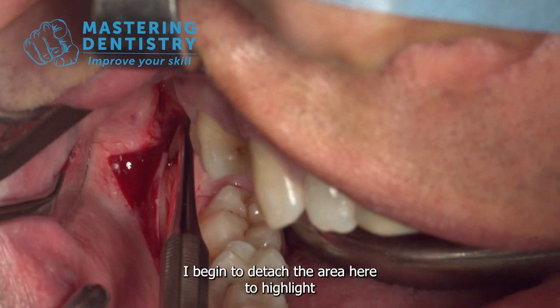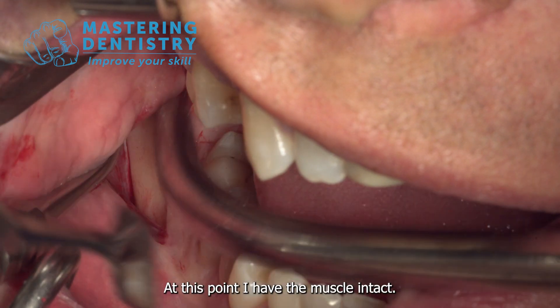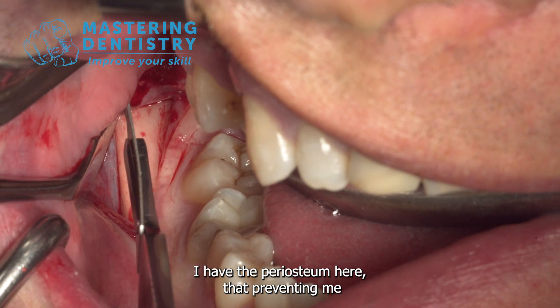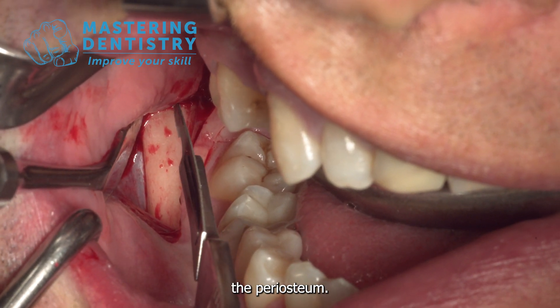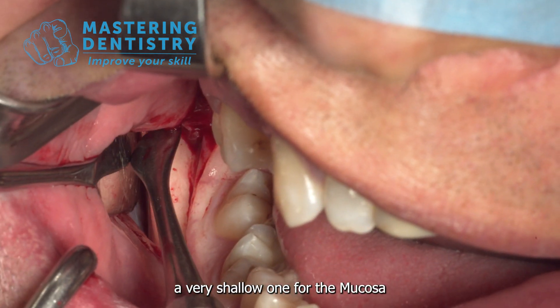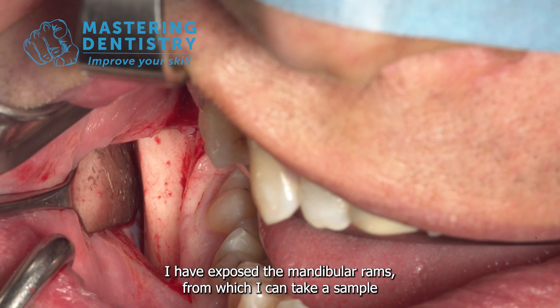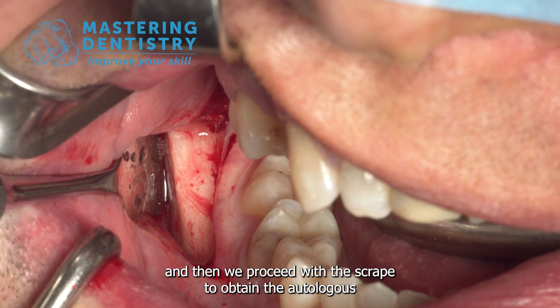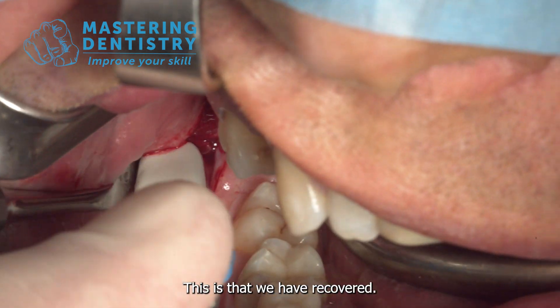I begin to detach the area here to highlight the mandibular ramus and insert myself underneath with the Britchard elevator. At this point the muscle is intact — you can see there is no bleeding. The periosteum is preventing me from dilating the flap further, so I go under the muscle and cut only the periosteum. The discharge cut is made in two different planes: a very shallow one for the mucosa and a deep one for the periosteum. I have exposed the mandibular ramus from which I take a sample — the autograft — moistened with saline solution. We then proceed with the scraper to obtain the autograft.